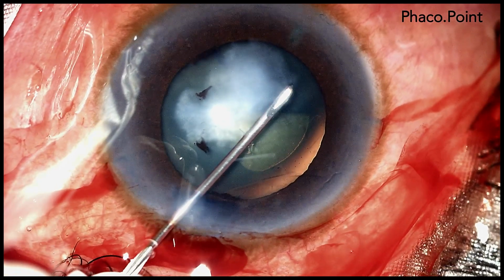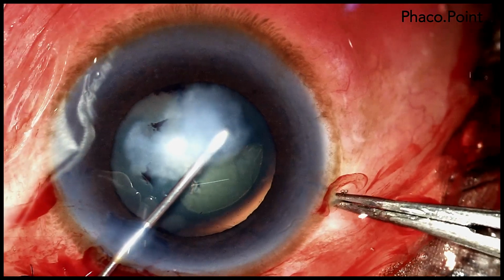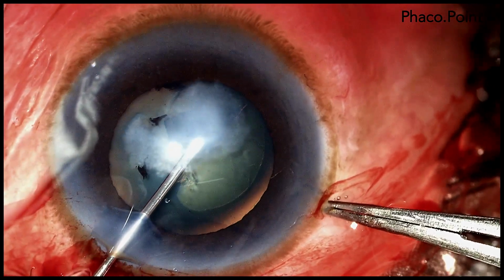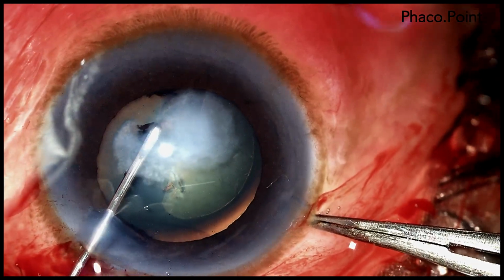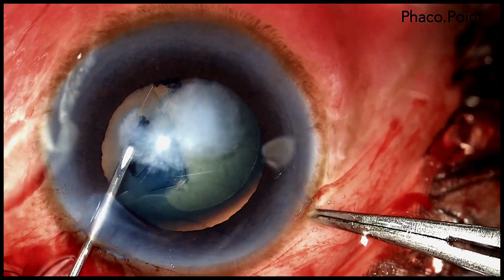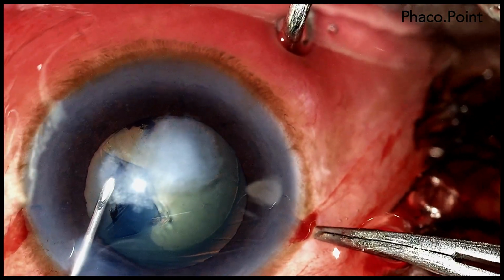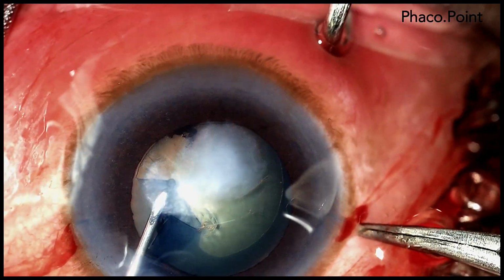The challenge of making the capsulorhexis starts at the area of the corneal opacity. Always ensure that when you're creating a rhexis in a patient like this, you have adequate globe stability. By moving the eye around to aid my visibility and take advantage of the limited red glow, I carefully navigate the tearing edge of the rhexis to circumvent the area of the corneal opacity to get back to the clear area of the cornea.